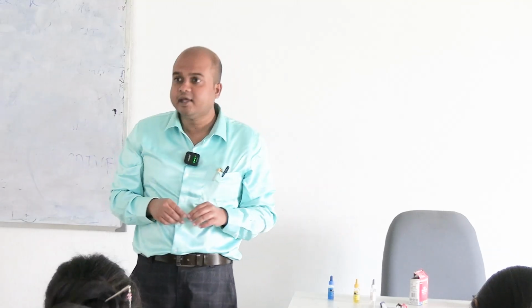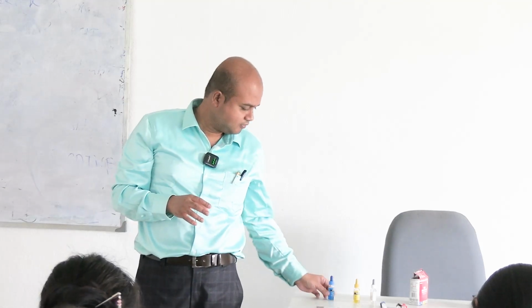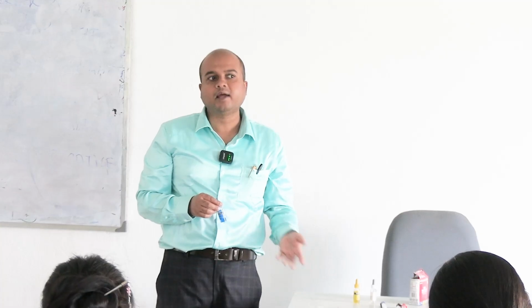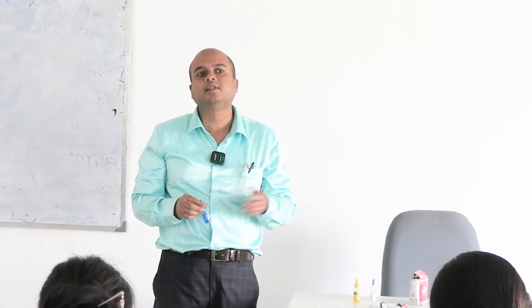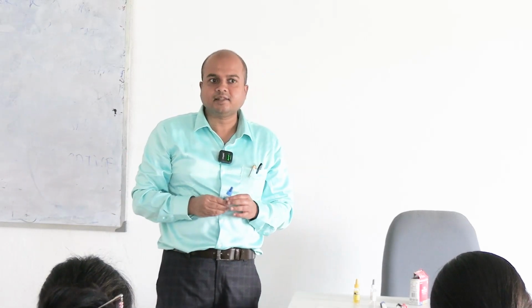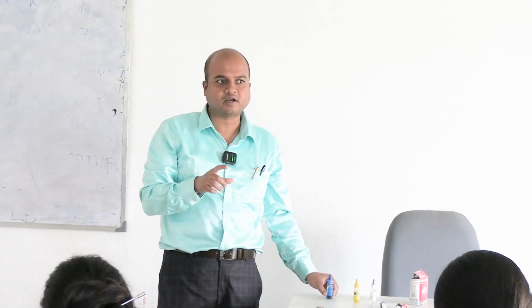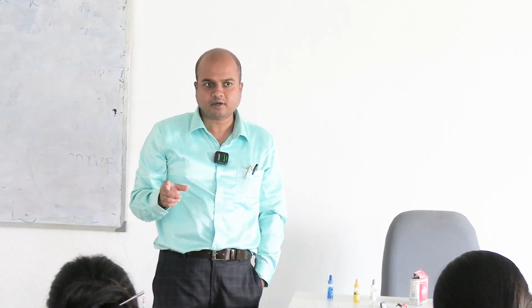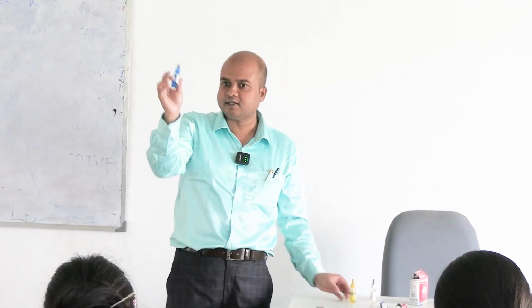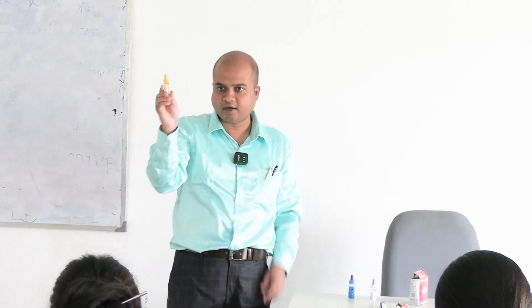If antigen A is present in an individual's blood, mixing it with the antisera will show an agglutination reaction. So on one section of the slide, labeled capital A, or label it anything: 1, 2, 3, just remembering that 1 is for A, 2 is for B and 3 is for D. If agglutination occurs in this A section, we can conclude antigen A is present on the surface. If agglutination is seen in the B section, then antigen B is present.